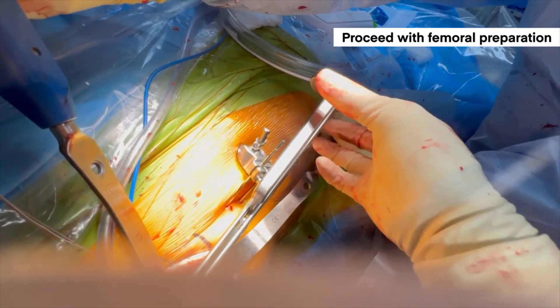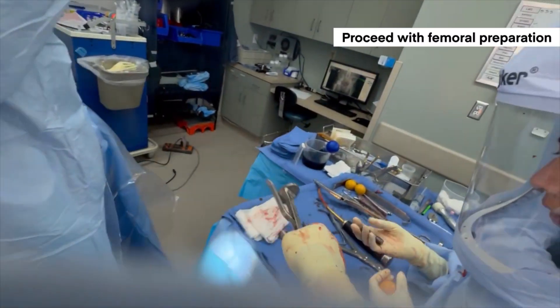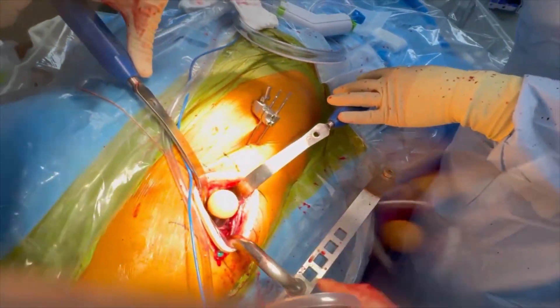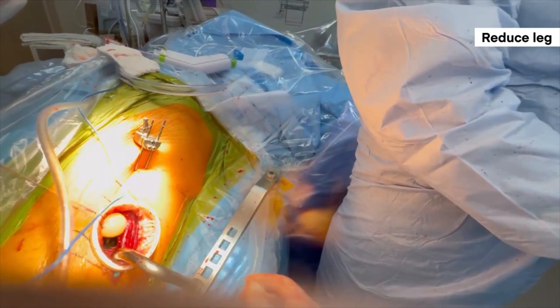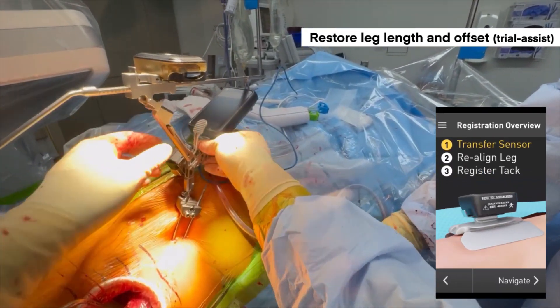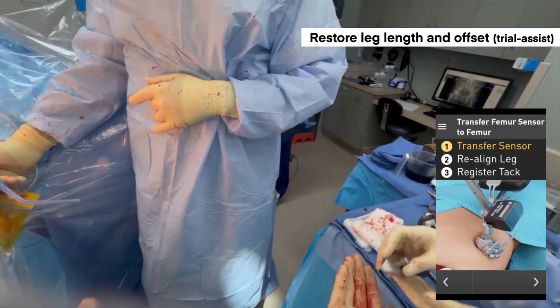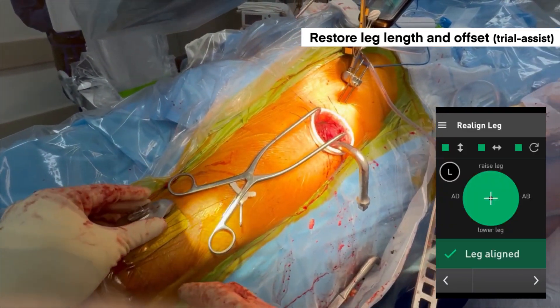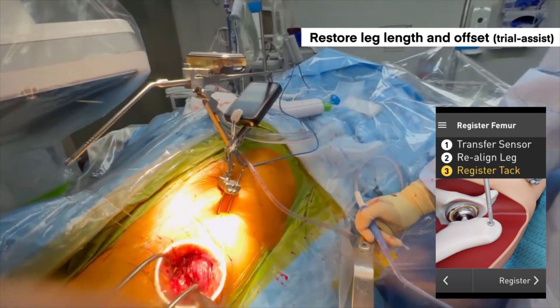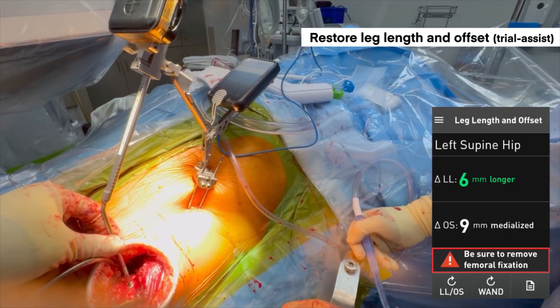I use a single offset broach for all of my cases through the anterior approach. Once satisfied with the broach size, I place the trial neck and trial head I think is appropriate and reduce the hip. We then use the Lantern Hip system to give us leg length and offset numbers during trialing. With the hip reduced, we get the magnetic base back onto the thigh mount, and similar to the initial registration step, register the hip position in the same neutral position as when we placed the femoral tack. The sensor goes onto the thigh mount, the probe into the femoral tack, and you hit register — giving you your leg length and offset values.